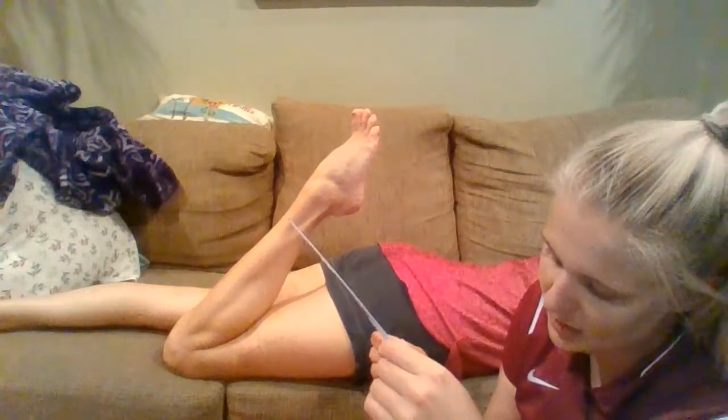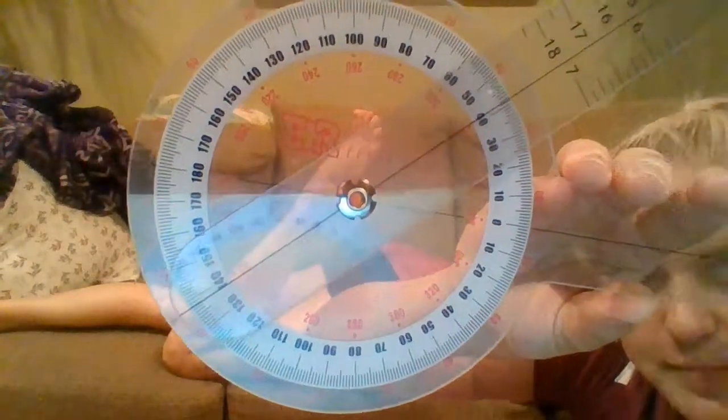And it looks like she is at approximately 138 degrees of knee flexion. That is for her right knee, and we will do the same measurement for her left knee.